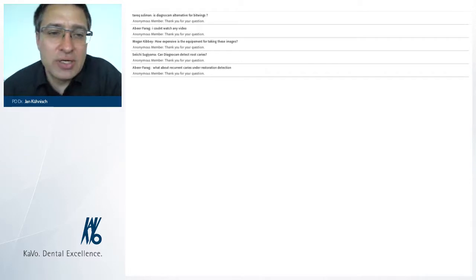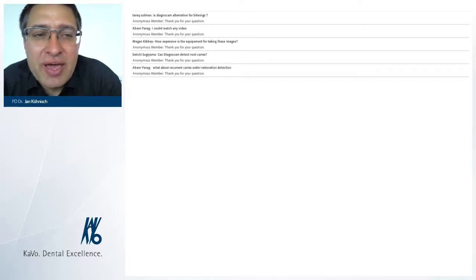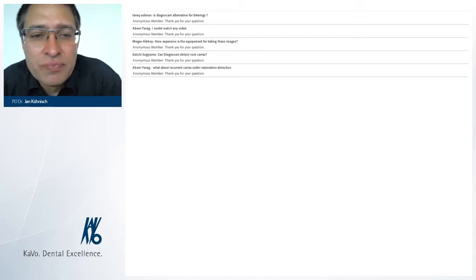Another question is about recurrent caries under restoration. I had shown to you the case with recurrent caries, secondary caries, or whatever it is named. Beneath to the oral or vestibular side, it can be detected easily, as you had seen in the video.